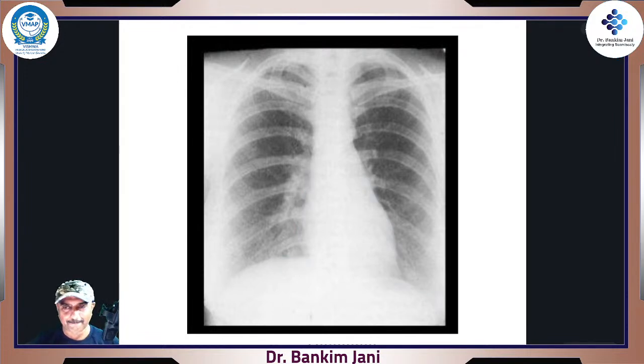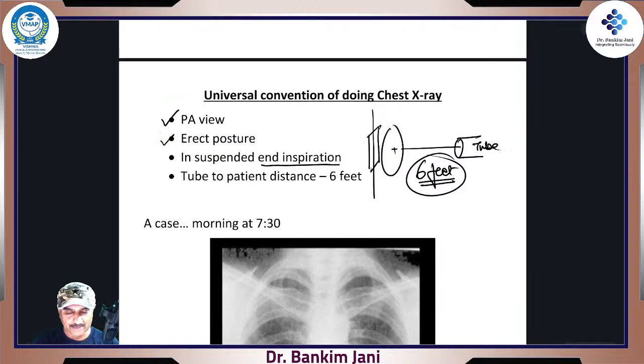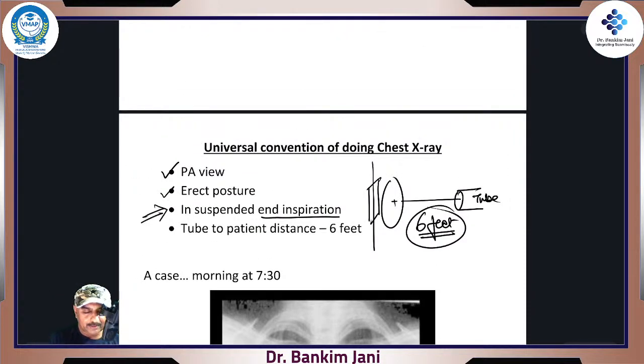Completely normal. Nothing much. The reason is, when the X-ray was taken, it was not in deep, suspended inspiration. So when it is taken in expiration, the lungs are not filled with air, especially the basal portion. This is the least filled, so this is the logic: crowding of vessels as there is no air. And unnecessarily it gives the appearance of basal consolidation. Nothing, because this portion was missed, suspended inspiration.